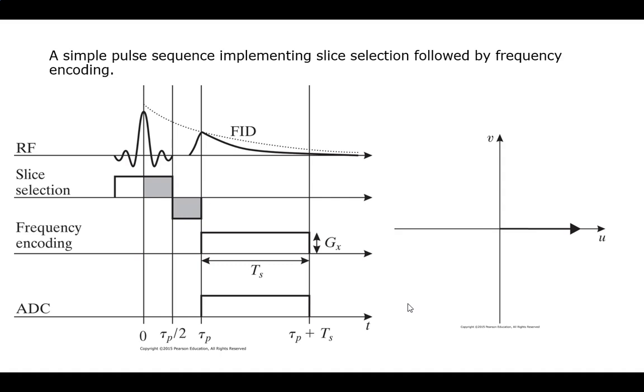So this will set my slice area, and I turn it on at the same time I give my RF kick. That means only the ones that are resonant with my adjustment of my frequency, which I do by the height, will respond. I set the Larmor frequency by how much I'm changing it with my Z gradient, and then I pick the RF kick to have that exact same frequency. So that slice and that slice only will resonate with it.